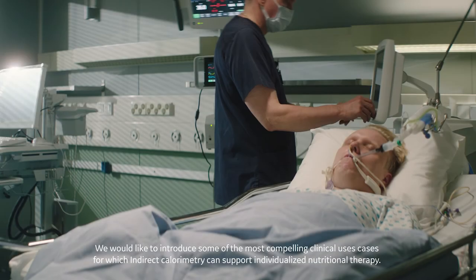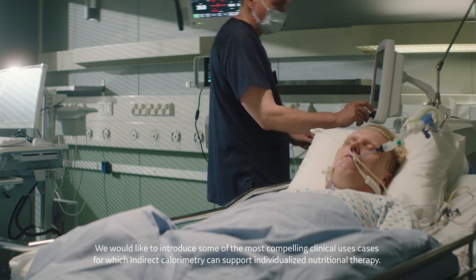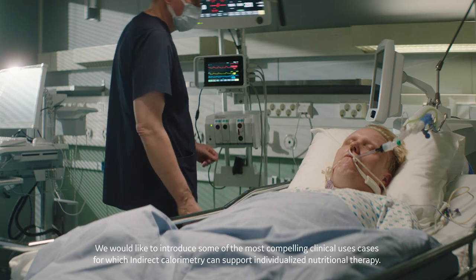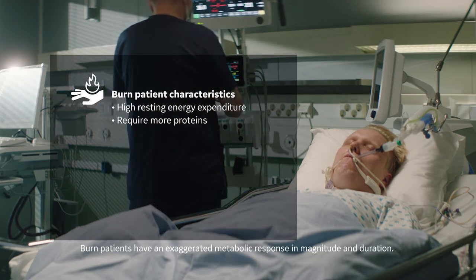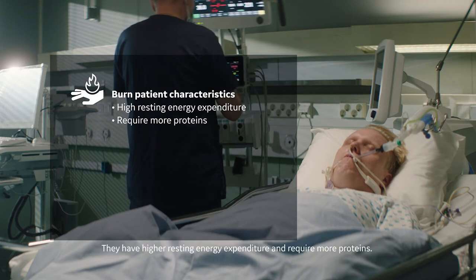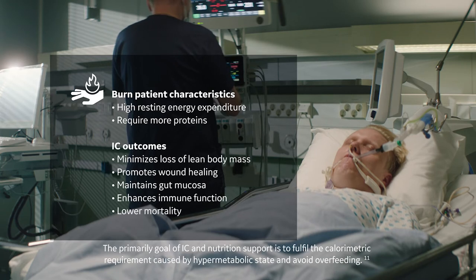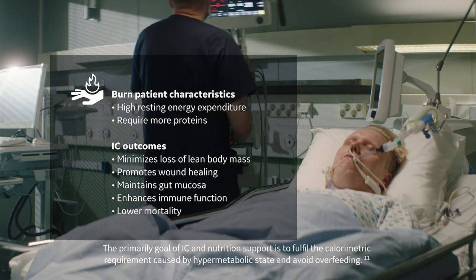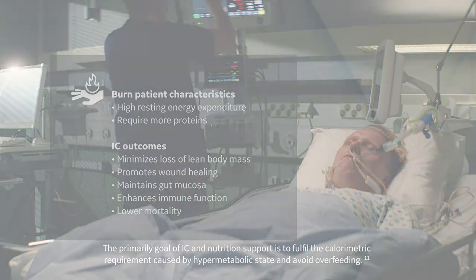We would now like to introduce some of the most compelling clinical use cases for which indirect calorimetry can support individualized nutritional therapy. Burn patients have an exaggerated metabolic response in magnitude and duration. They have higher resting energy expenditure and require more proteins. The primary goal of indirect calorimetry and nutrition support is to fulfill the calorimetric requirement caused by hypermetabolic state and to avoid overfeeding.